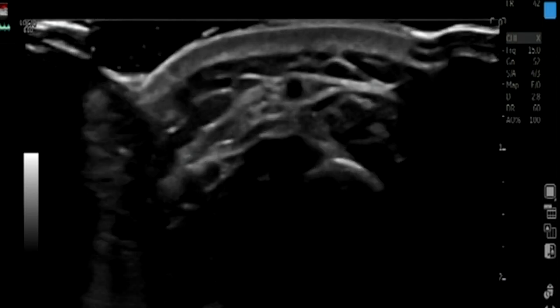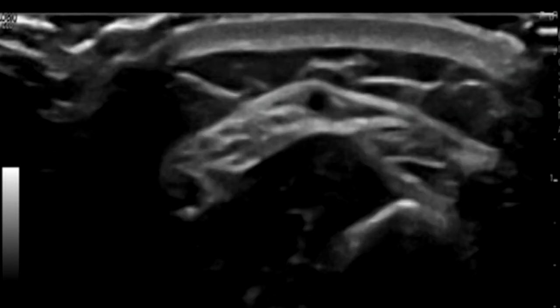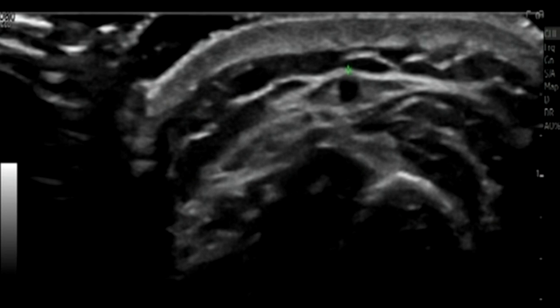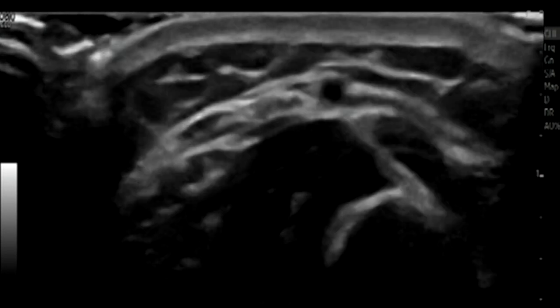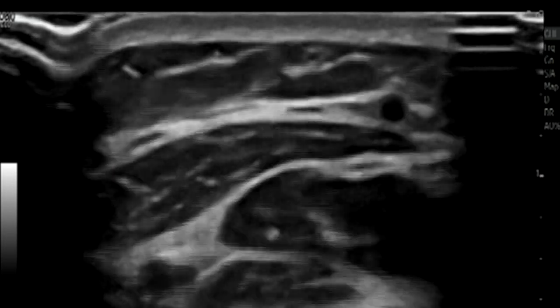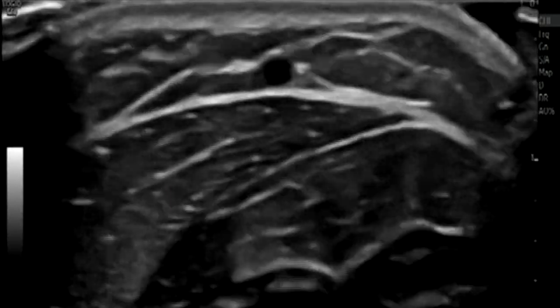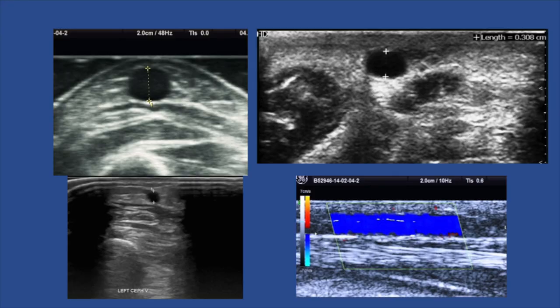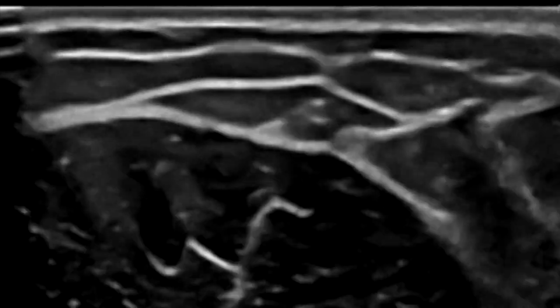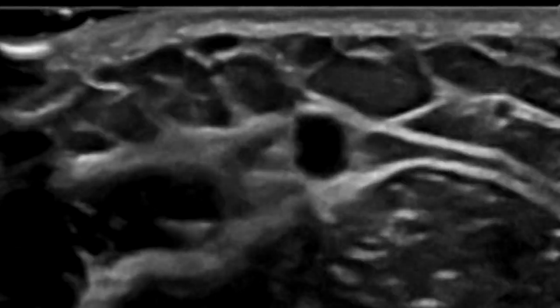Now evaluate the cephalic vein, which is the best vein for making a radiocephalic fistula. Use copious gel with very minimal compression so as not to compress the vein, ensuring accurate readings of the vessel caliber. Measure the cephalic vein distally in the forearm — the diameter here is around 1.6 mm. Moving more proximally into the mid and proximal forearm, the reading is around 1.8 mm — slightly better. The vessel becomes of bigger caliber as we move cranially. B-mode is best here, as it gives a good picture of compressibility to rule out thrombosis, and you can beautifully see wall thickening of the vein.